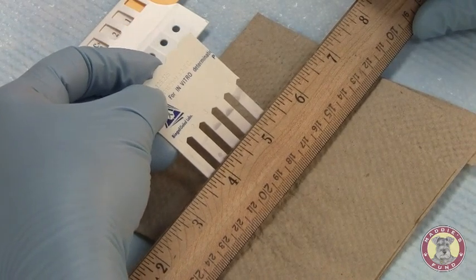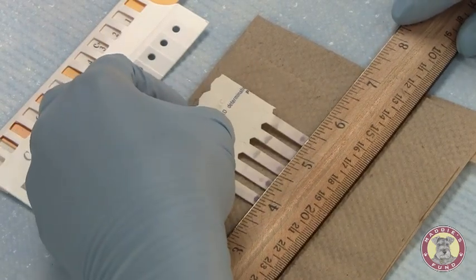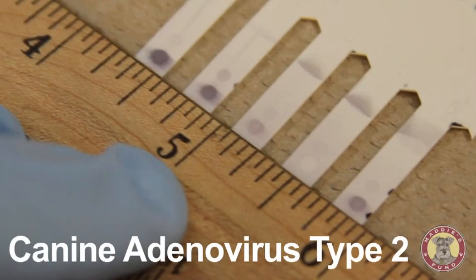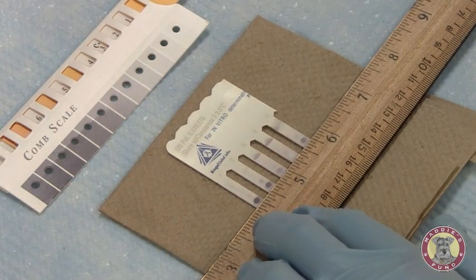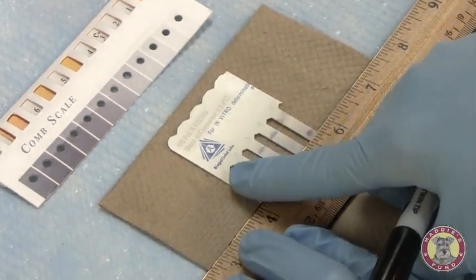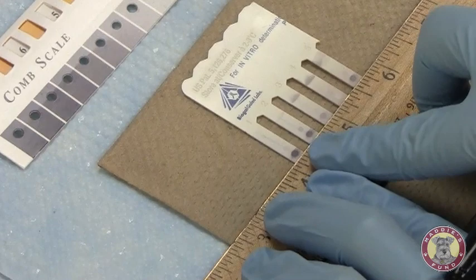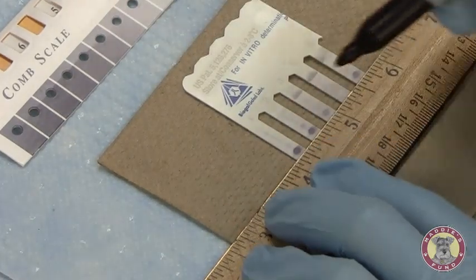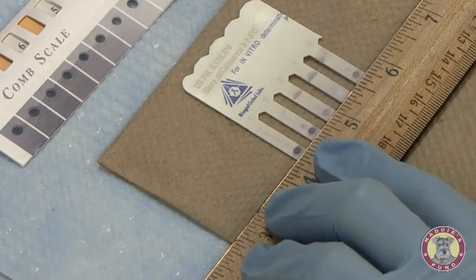The first row of dots is the positive control. Using my straight edge, I'm going to look at the second row of dots. This row represents the antibody present for canine adenovirus. For sample 1, loaded in tooth number 1, you can see I have a very dark color development. A higher number would correspond to that darker development, so I will call this a 6.